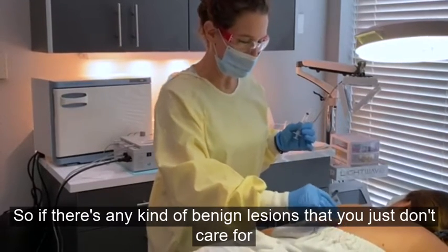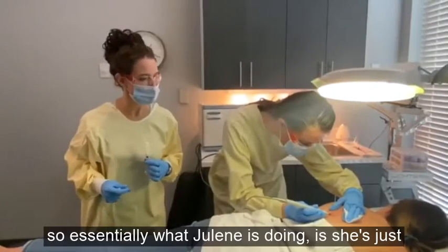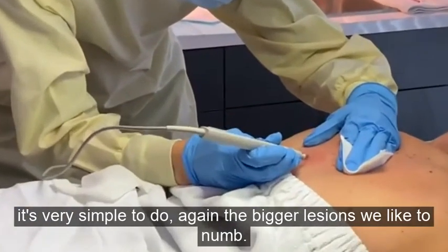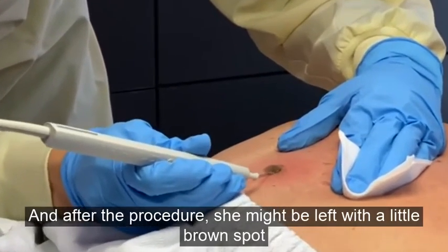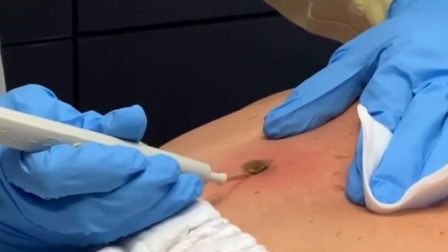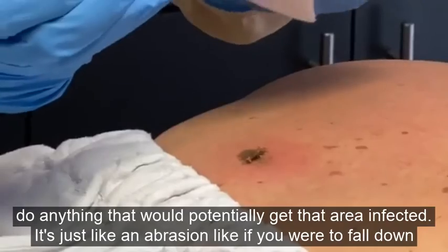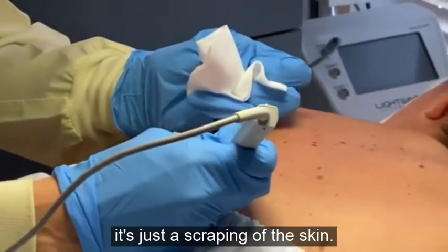If there are any benign lesions you just don't care for anymore, let's get rid of them. Essentially what Julene is doing is scraping that lesion right off the top of the skin — it's very simple. For bigger lesions we definitely like to numb first. After the procedure, the patient might be left with a little brown spot, but that will heal up in a day or two. I'd tell our patient not to go swimming or do anything that could get the area infected — it's just like an abrasion, like scraping your knee.